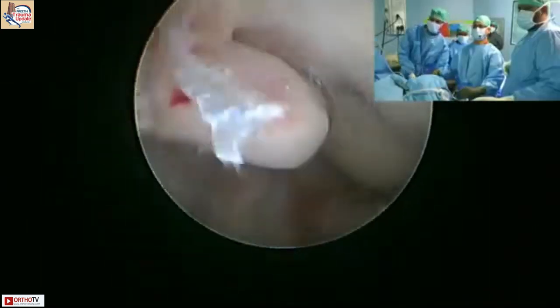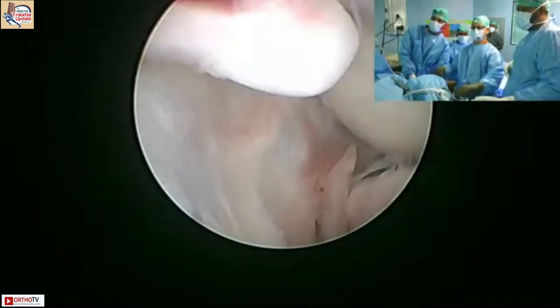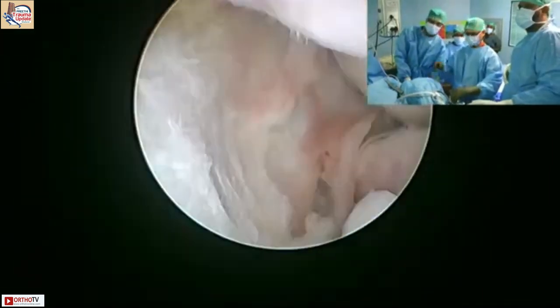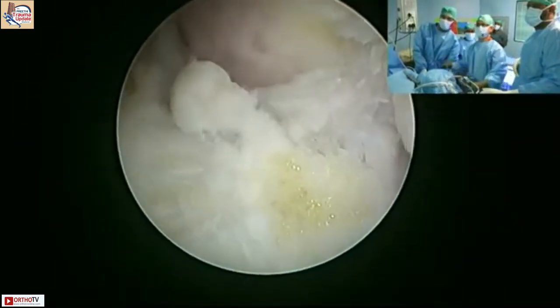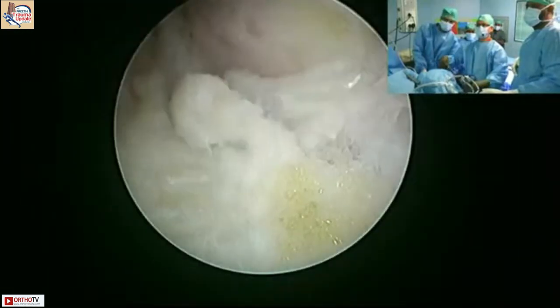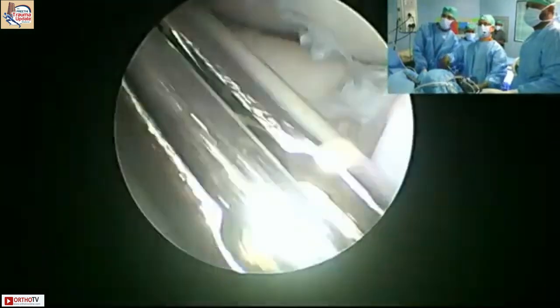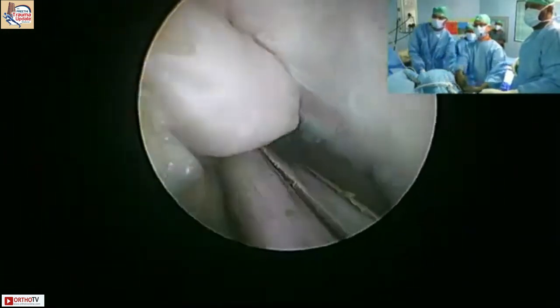If anybody is attending cadaveric wrist scopy courses, one of the first exercises we do is we tie up a capsicum and then we ask you to scope and pick up the seeds. That's the first exercise in a wrist scopy cadaveric course, and it's so beautiful inside a capsicum, with all the loose bodies. So your triangulation, your dexterity comes with that. So we start off.